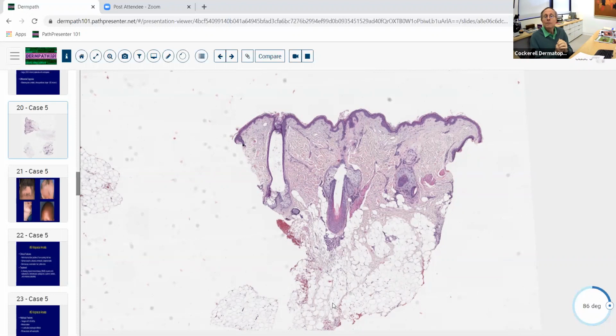If there are any fibrotic tracts, the sites of extinct follicles, it's not really exactly scar tissue, but that's going to help you. Are there fibrous stelae sitting on the subcutaneous fat? That's going to help you. And then, are the follicles all in the same stage of evolution? Like in alopecia areata, you may not get much inflammation sometimes if everything's been shifted. It's in the same stage at the same time. That favors AA.